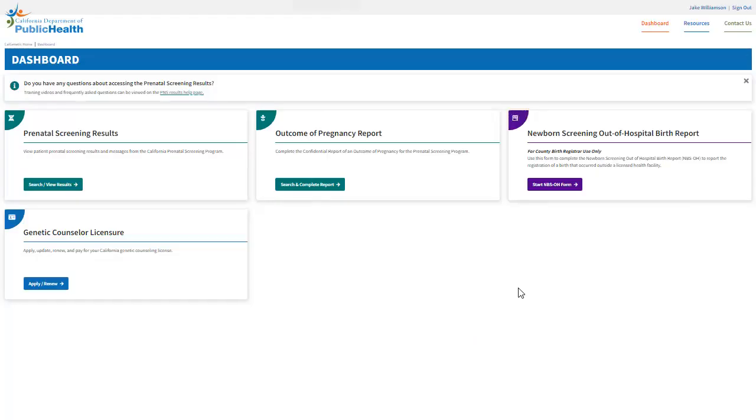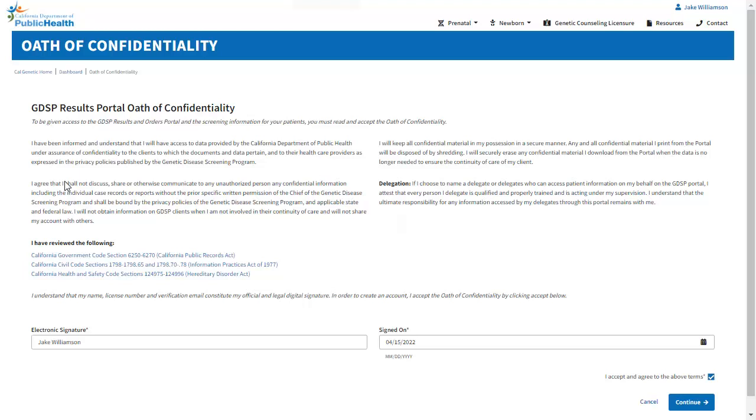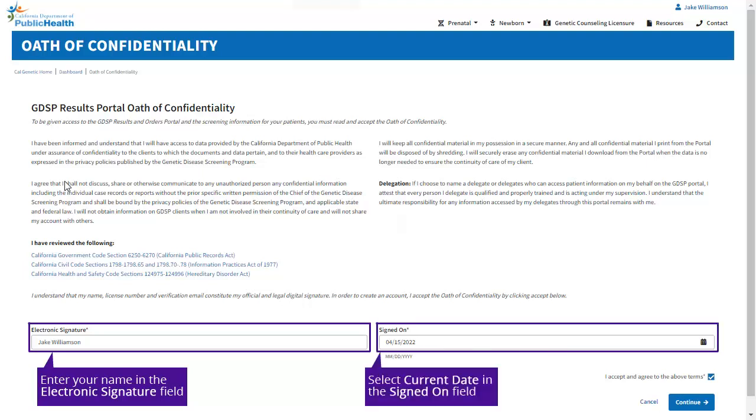To access the results portal, click Search View Results on the Prenatal Screening Results tile. You will be redirected to the Oath of Confidentiality screen to provide your electronic signature and the current date, then click Continue.